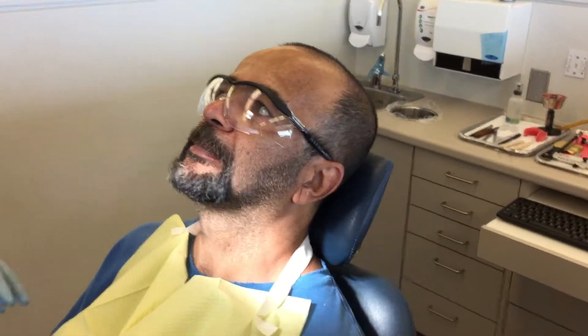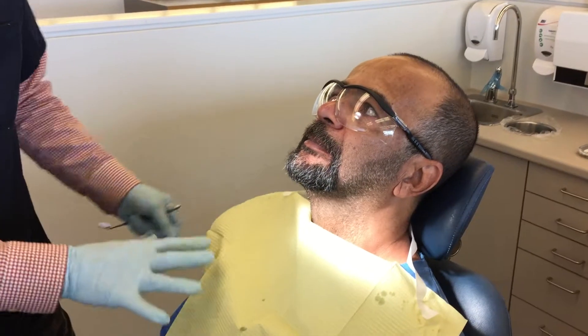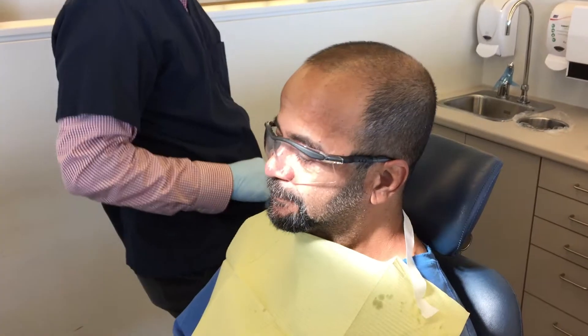As good as this is today, Robert, by the time we finish the denture in acrylic, it's going to be even better, because I had to relieve some of the underside of the bite block in order to prevent damaging the model. So as good as it is today, I think it will get better.